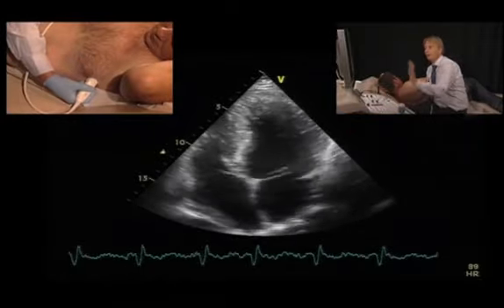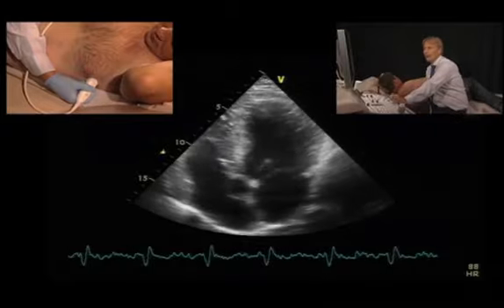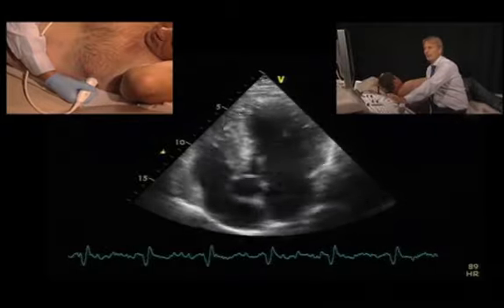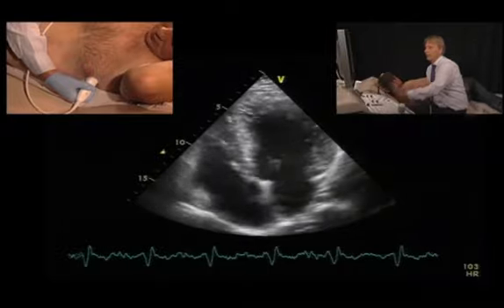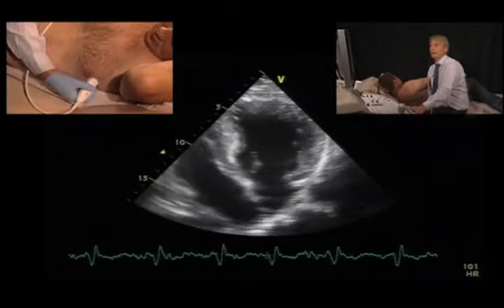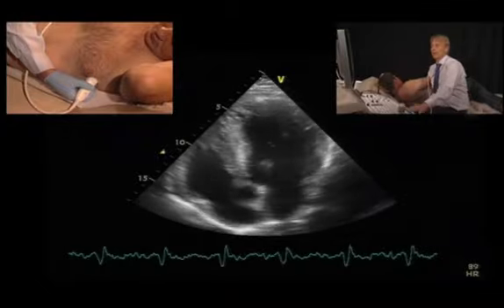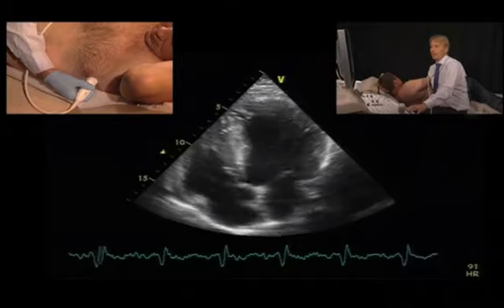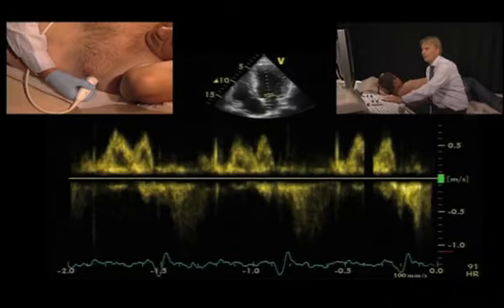Just by purely looking at the 2D image, you can recognize that the patient has severe left ventricular hypertrophy, he has hypertrophic cardiomyopathy, and such patients just cannot have normal diastolic function. So clearly, all you would need to have is the 2D image. And there's another way of looking at it. Let's take a look at the pulsed-wave Doppler signal again.